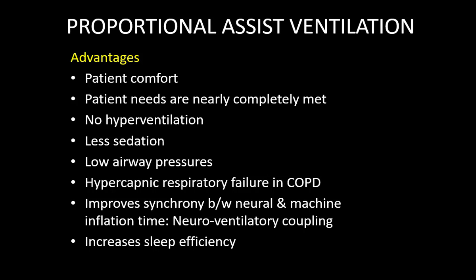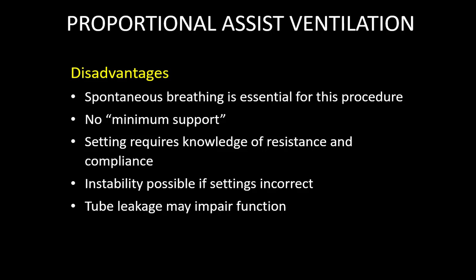It improves synchrony between neural and mechanical inflation time. So neuroventilatory coupling is there and it increases sleep efficiency. Certain disadvantages are there. Spontaneous breathing is essential for this process. There is no minimal support. So if suddenly the patient goes into apnea, you have to set the backup for apnea. Otherwise the patient starts hypoventilating, and the ventilator will sit easily and allow the patient to hypoventilate. That is one challenge.